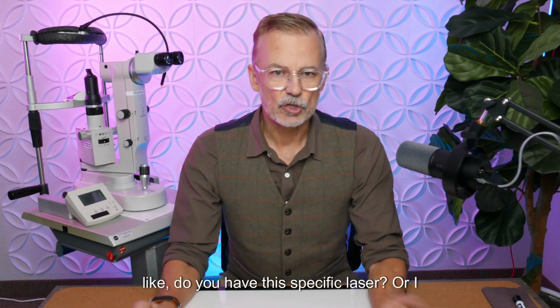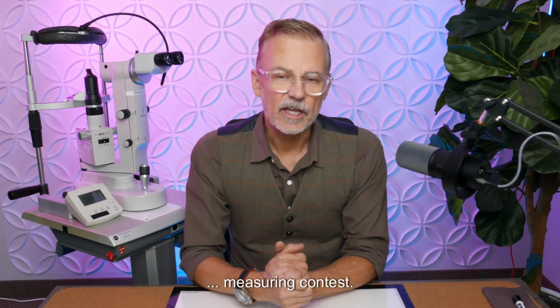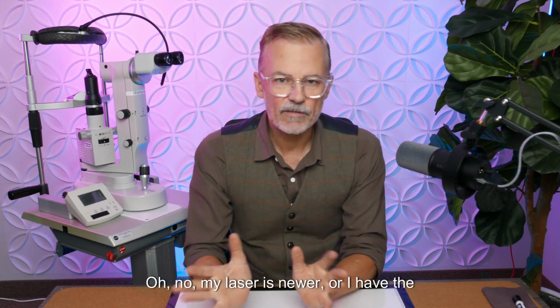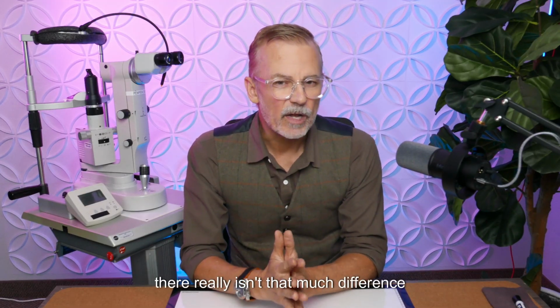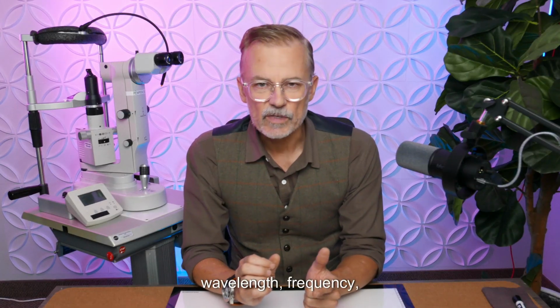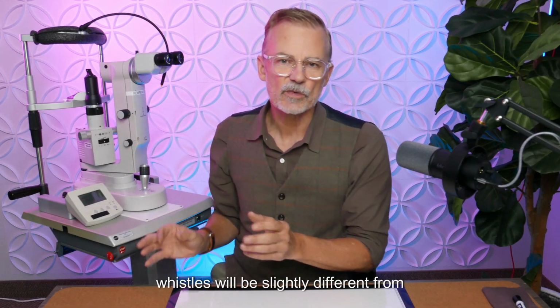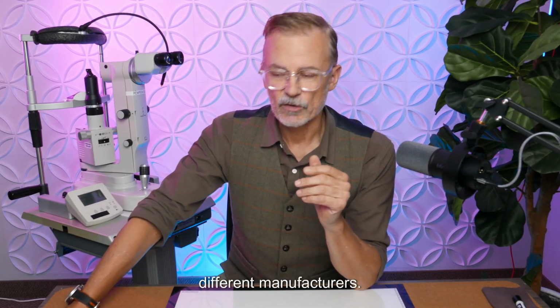Some people will contact me and they're like, do you have this specific laser? Or I read that this is the better laser. I tend not to get into a measuring contest. Oh no, my laser is newer, or I have the newest laser. I'm going to go out on a limb here and say there really isn't that much difference between the lasers. They all have more or less the same wavelength, frequency, energy range. The knobs and some of the bells and whistles will be slightly different from each other. But there's not that much difference between the different manufacturers.